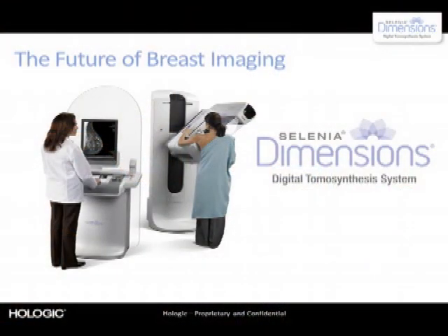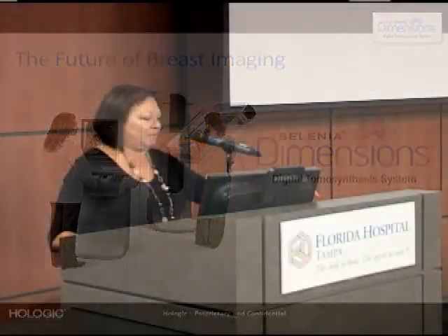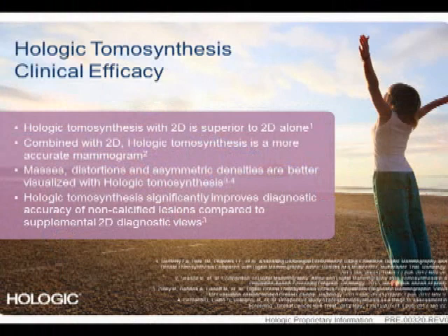It's very fast. Nothing will change for the technologist. The positioning is the same. The exam is transparent to the patient as well. And you'll start to see the tube head move down 7 degrees. Exposure initiates, 15 degrees, 15 exposures, back to 0, 2D exposure made, and she's done. That's it. Just that fast. And I won't go over the rest of it, but as I said before, you can do this in any mammography angle, classic or otherwise.